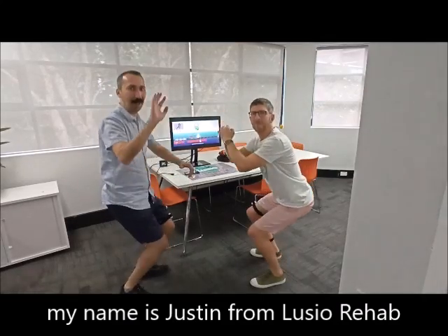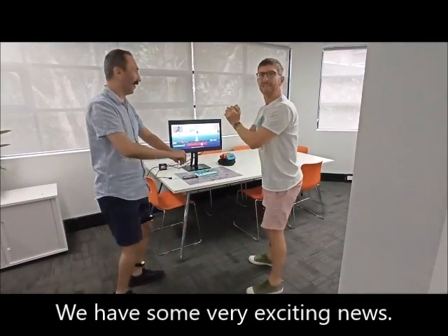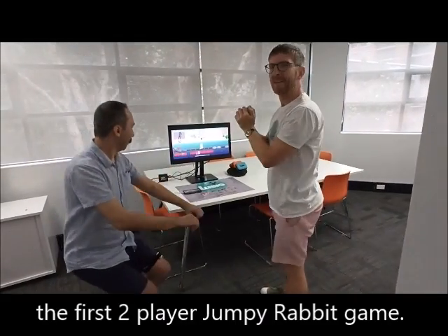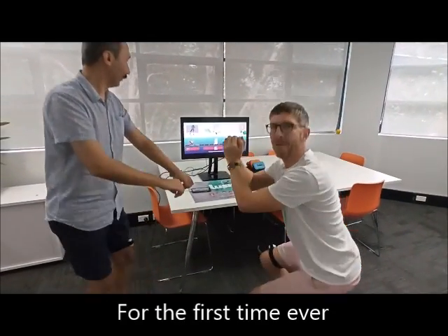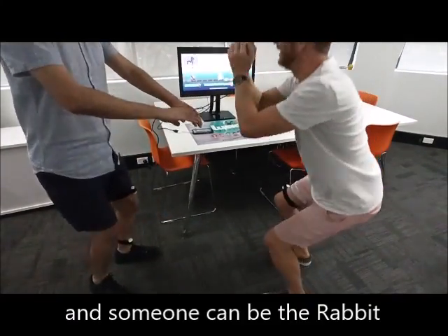Hello everyone, my name is Justin from UCI Rehab. This is Armin, our CTO. I've got some very exciting news. In the background here you can see the first two-player Jumpy Rabbit. For the first time ever, someone can be the wolf and someone can be the rabbit. It's game on.